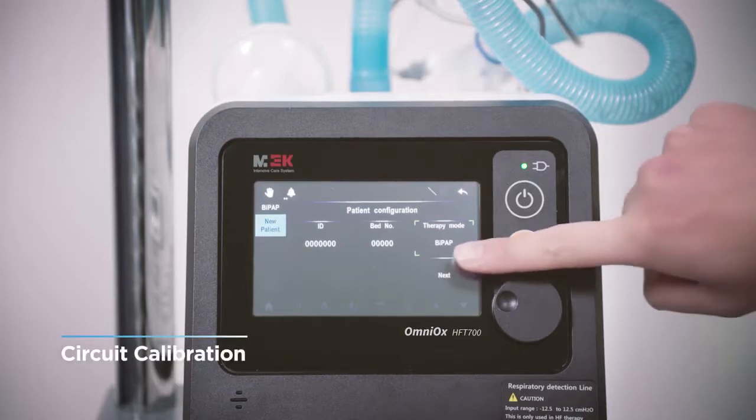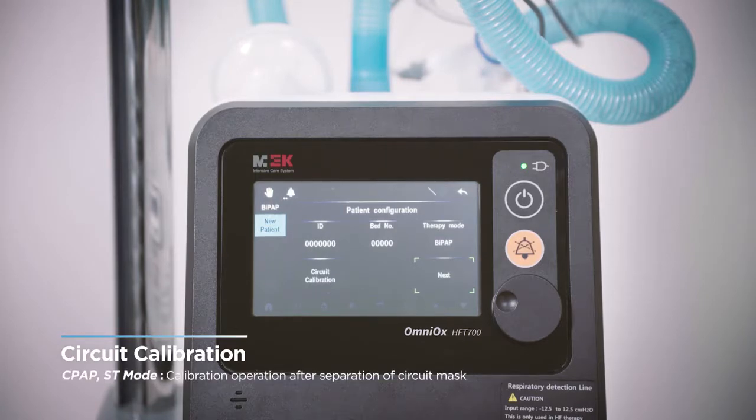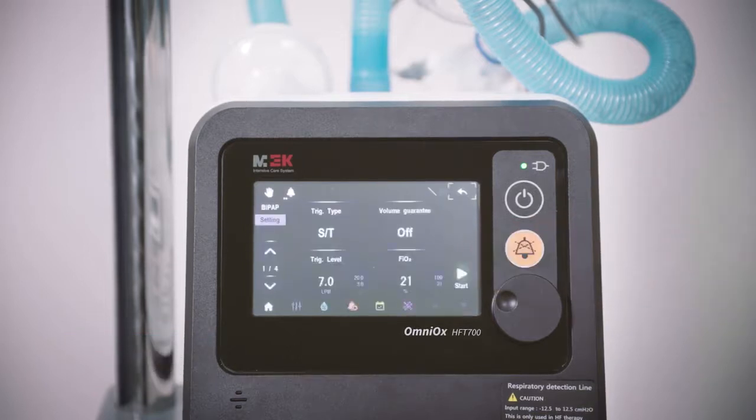After selecting the desired treatment mode and pressing the next button, the cannula calibration button appears. In HF mode, press the cannula calibration button with all accessories including the cannula connected. In the case of CPAP and ST mode, press the circuit calibration button with the circuit and mask separated. When calibration is complete and confirmed, the device is ready to begin therapy.